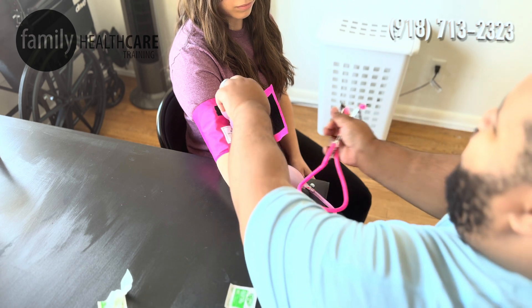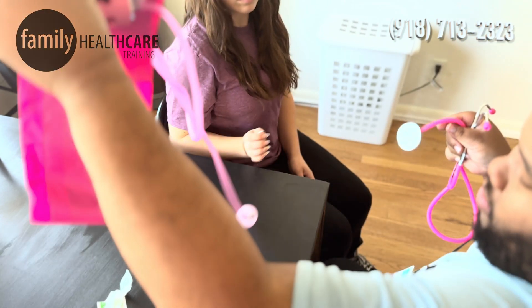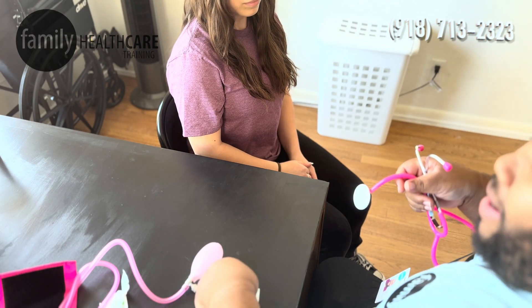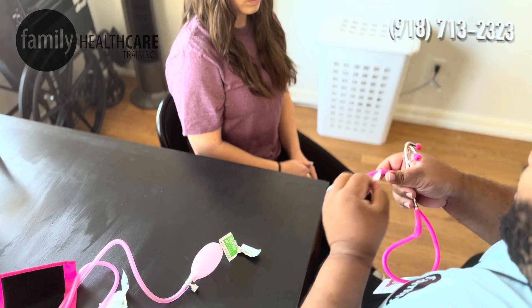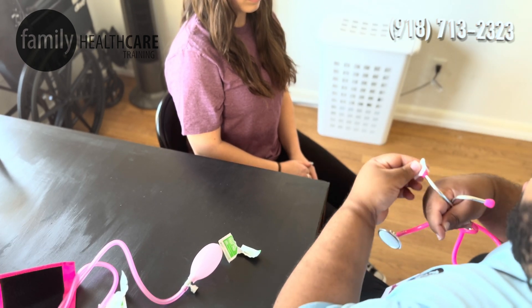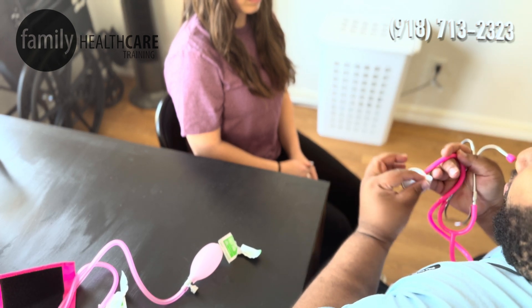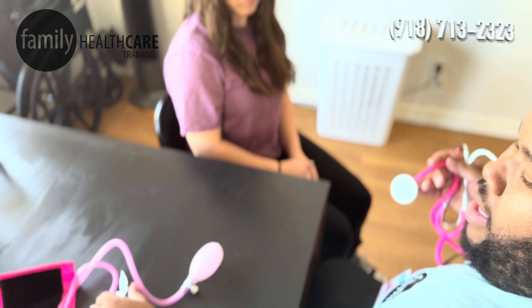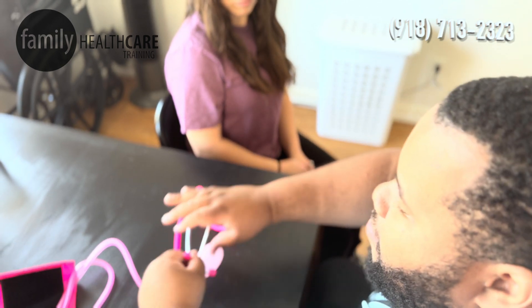At that point I'm going to take the cuff off of my patient. I take my second alcohol packet and clean my stethoscope a second time. I clean up my trash, put my blood pressure cuff away, and put away my stethoscope.